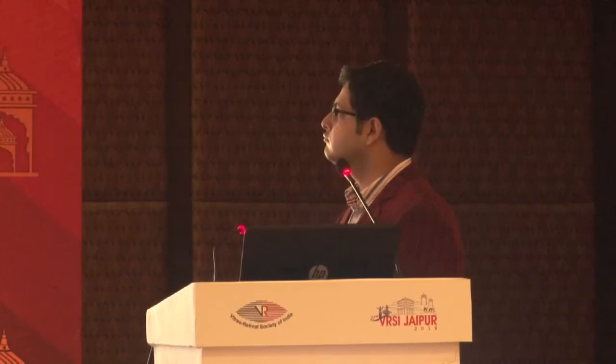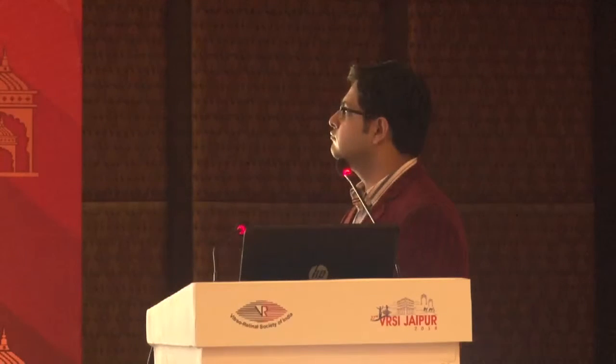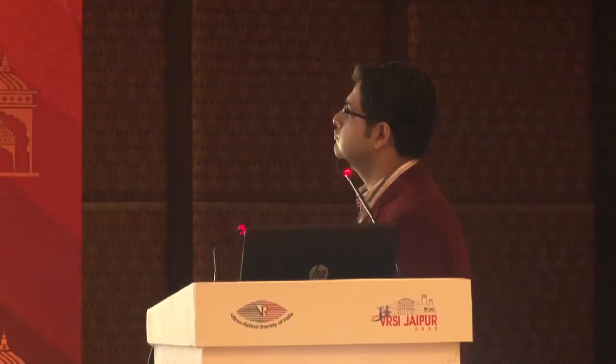Post-operatively, the retina remained attached and the vision improved to counting fingers at 2 meters after silicone oil removal. To conclude, pediatric retinal detachments are a management challenge. Even though they are often associated with a guarded visual outcome, careful ophthalmic evaluation and management of these children can provide ambulatory vision and profoundly impact the lives of these young patients. Thank you.